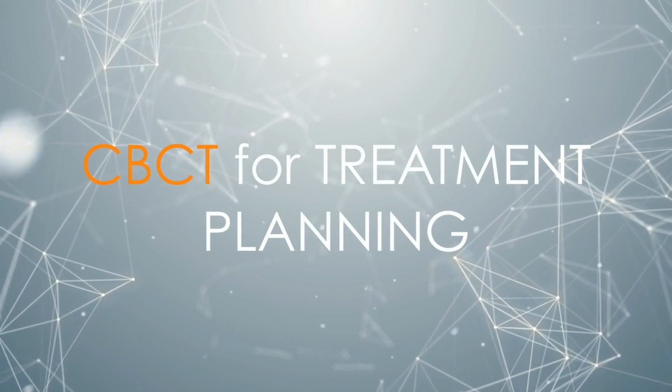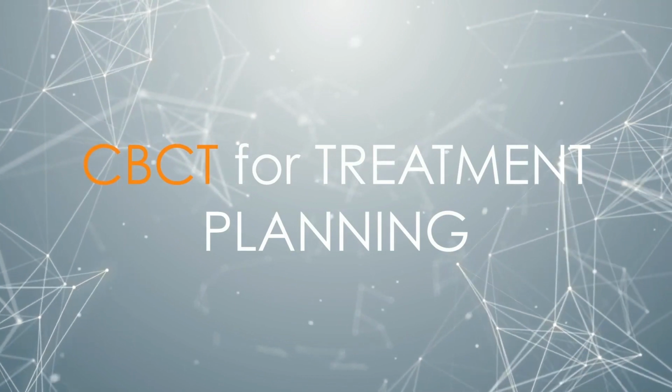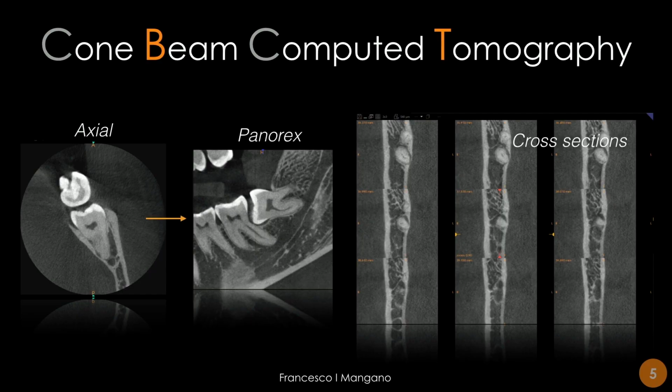This is quite important particularly in the field of surgery, but not only in the field of surgery. Why? Because the use of DICOM file can change the way we treat our patients, and it can change it dramatically. We can really benefit from the machine.